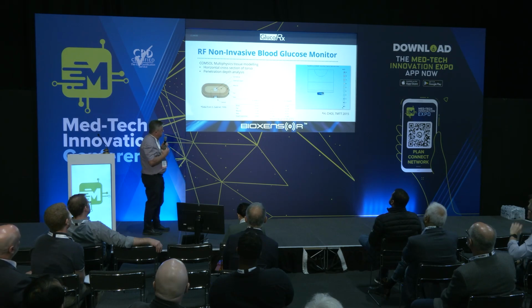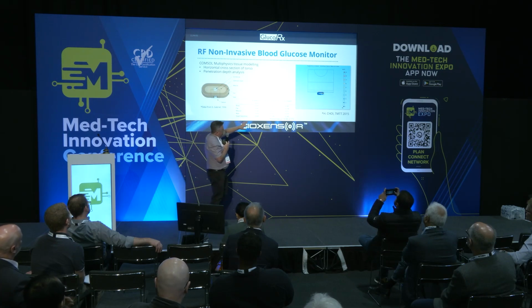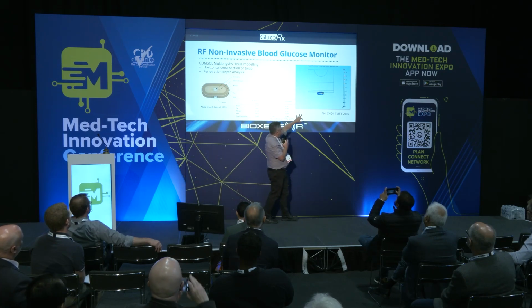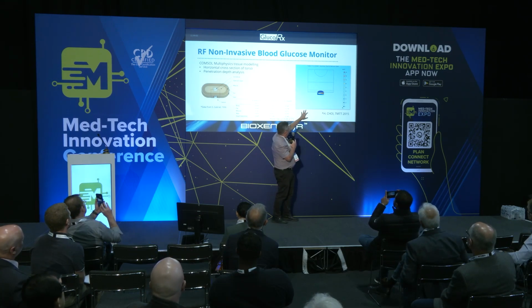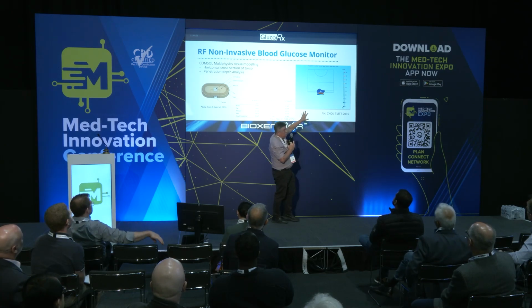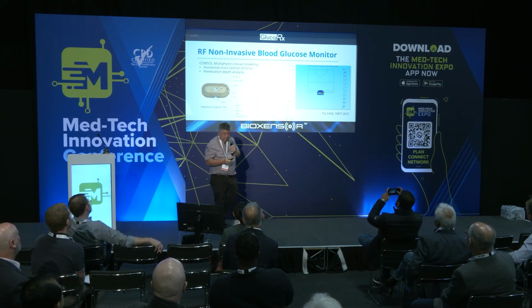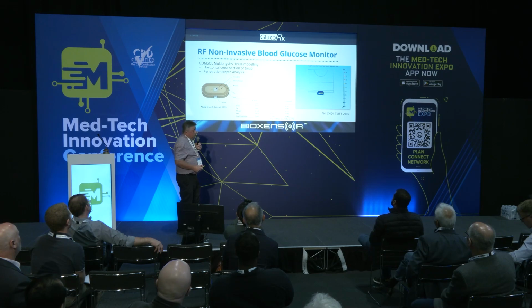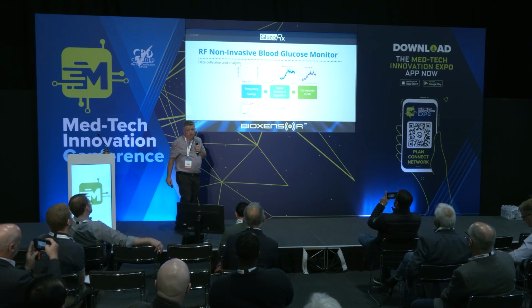So what we've got here is models, for example, of the skin. And if you've got good eyesight, you can see here, this is a 3D electromagnetic simulation of the radio waves from our sensor penetrating through quite a few millimeters of skin, getting to fairly deep blood vessels, which is what we want. We tend to wear the sensors on the arm or the upper torso because we want to try and minimize movement. And this is basically how we generate a signal.